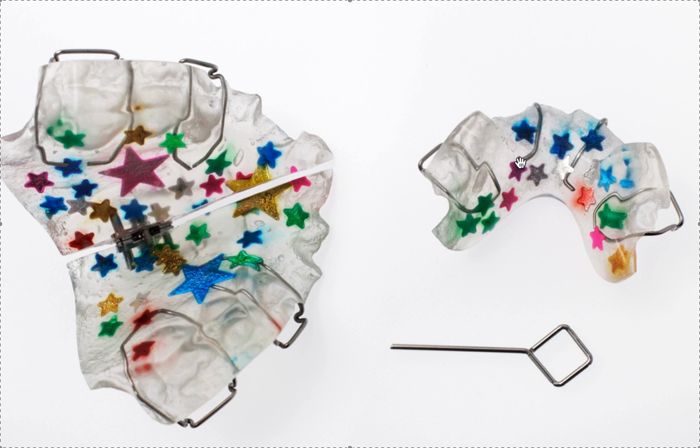So that's why I said it's better on littler kids, because a lot of big kids are not going to wear these kind of chunky appliances 22 hours a day at school. They're going to take them out. And they're not going to wear them, and the parents aren't going to know, and you're going to see no change, and then everyone's going to get upset. So you have to be crystal clear on case selection.